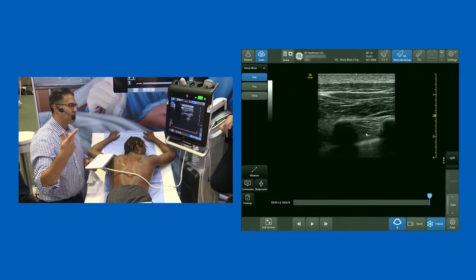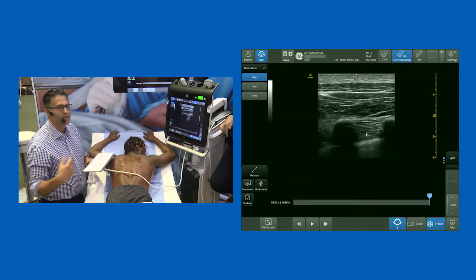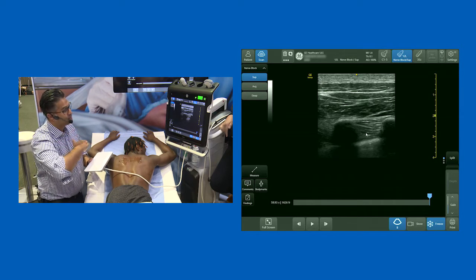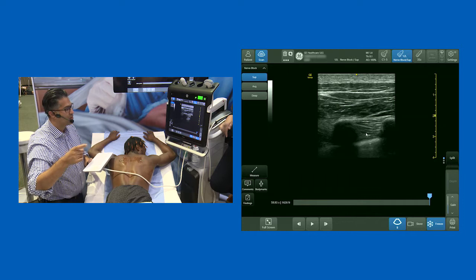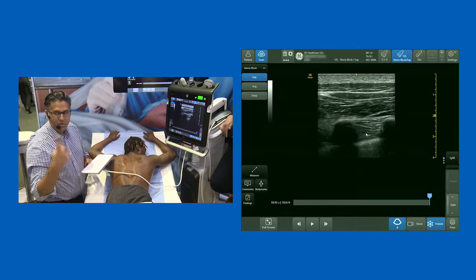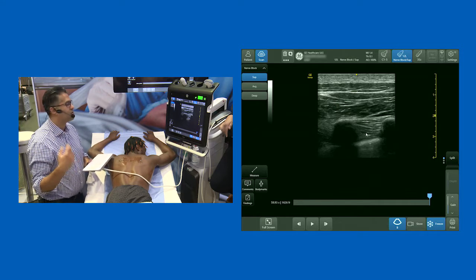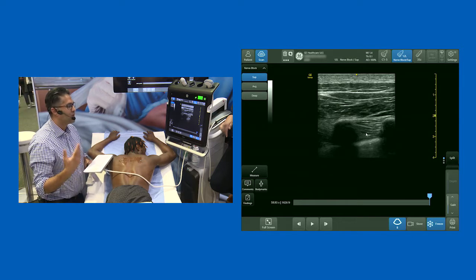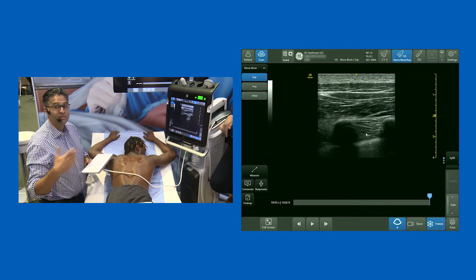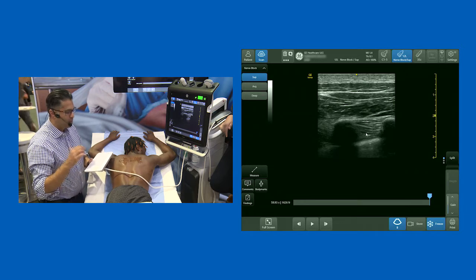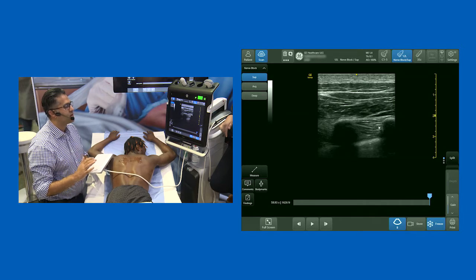Sometimes the patient can feel the pop, sometimes you can hear it — it's like a cannulation feeling, you know when you get into a vessel. I use a test dose of local anesthetic, see the pleura drop down, then switch my syringe from a lidocaine or adrenaline-containing lidocaine solution to my volume of local anesthetic. I do a single level of 20mls of local anesthetic, and in real time when you assess the spread you get about three to five, sometimes six levels of paravertebral spread.